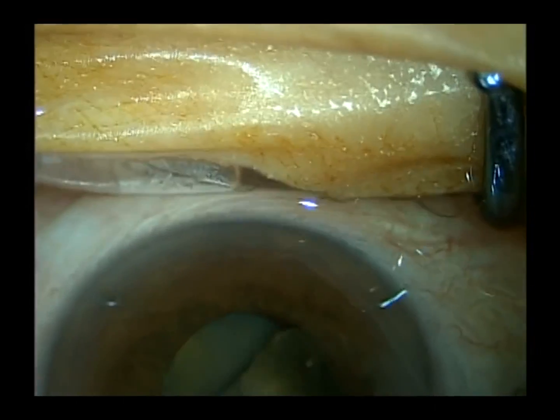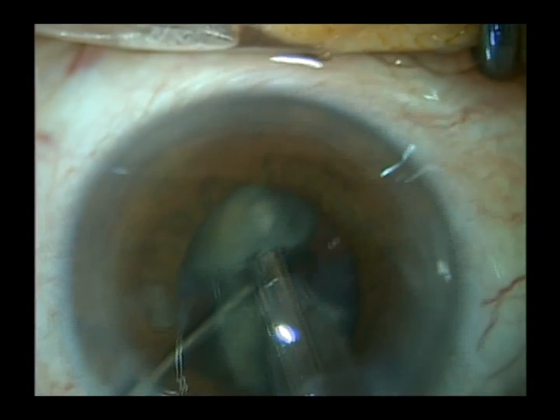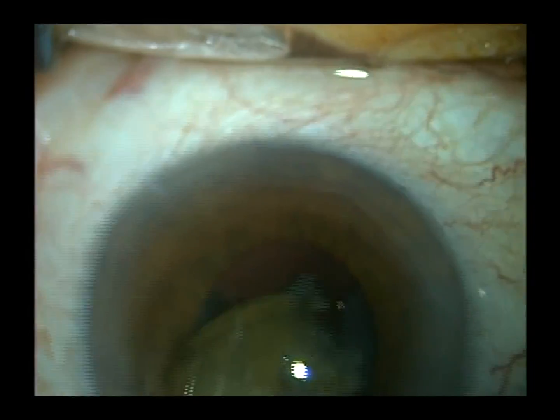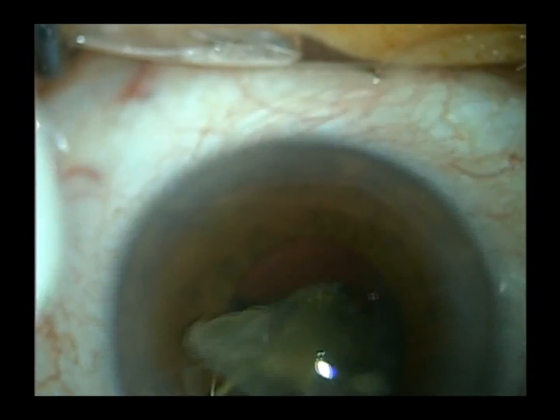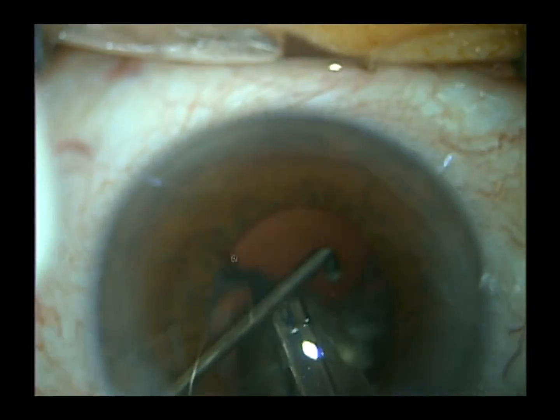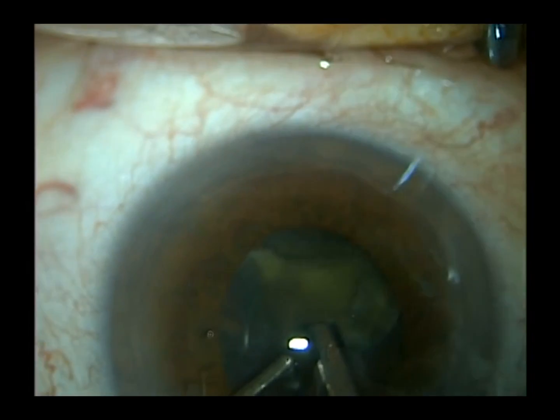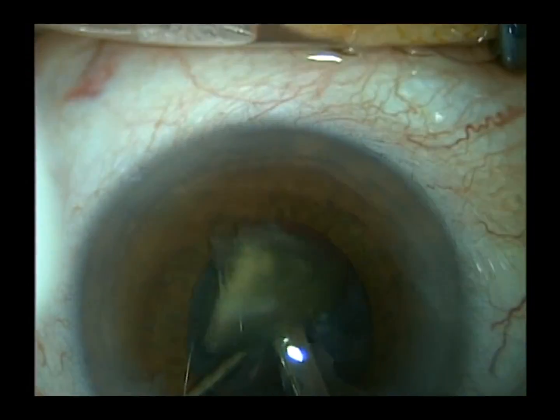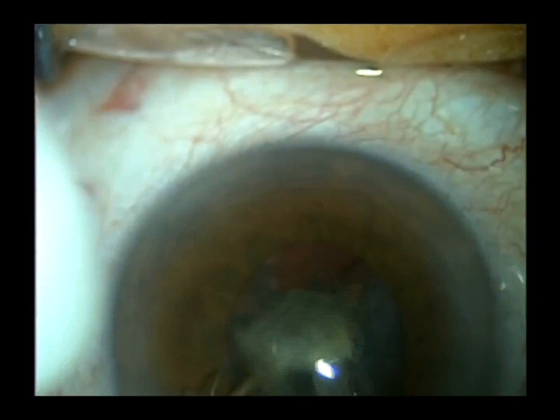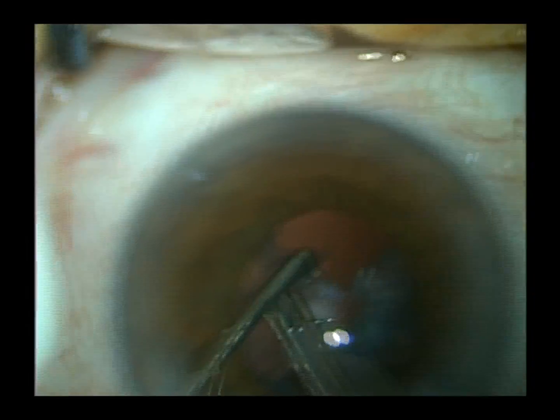I'll use the second instrument and place it behind the nuclear fragments as I phaco, and that's just an extra safety measure to prevent the phaco tip from inadvertently nicking the posterior capsule while we're on higher vacuum mode. Again, this is my last fragment. My second instrument goes behind or posterior to the nucleus as I emulsify these last fragments.